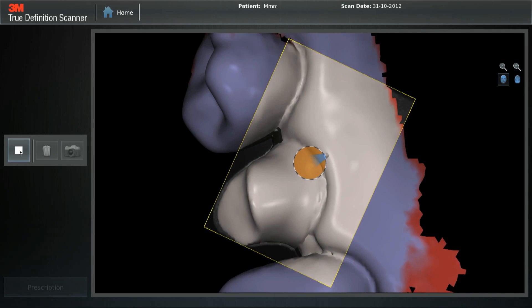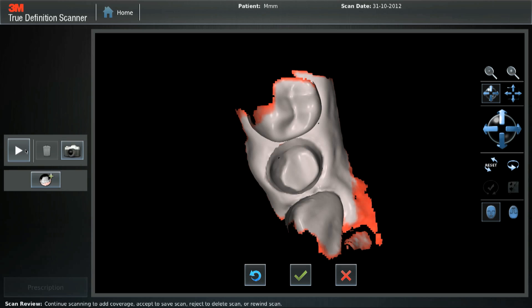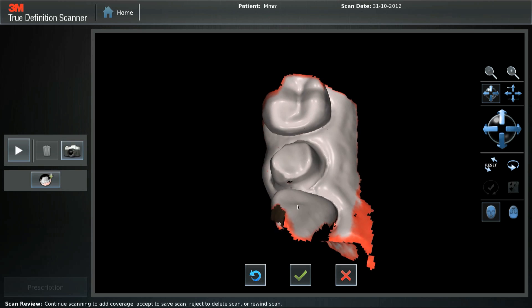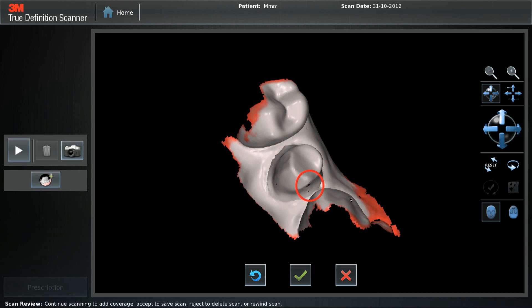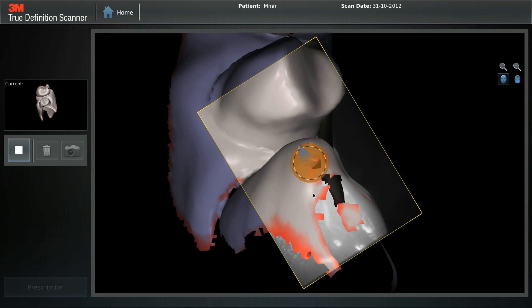Stop the scan and review the mesh data displayed on the screen. If there are data holes, they can be patched by a subsequent scan. The next step is to save and confirm your prep in video mode.